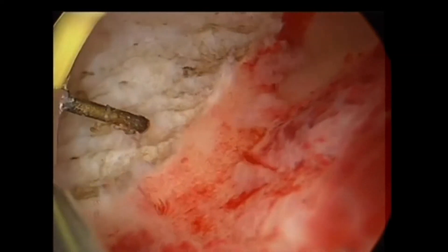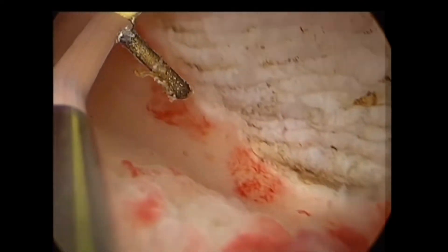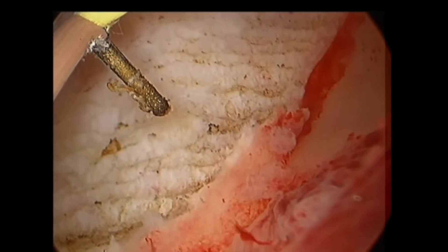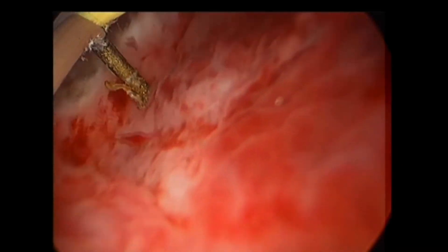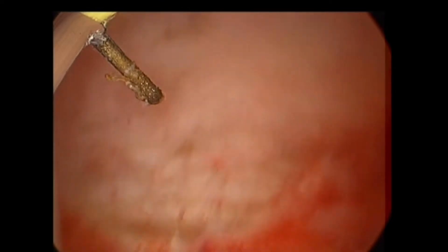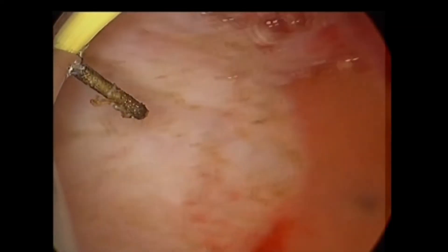Look at the endometrium here and the septum scar here — there is no residual tissue, which proves there is no need to excise. I'll decrease the fluid pressure now to allow the septum scar to collapse and the uterine walls to fall down. You will see some bleeding, meaning intrauterine pressure is low, but still there is no bulging tissue. The septal scar is even at a lower level than the rest of the endometrium, confirming there is no need to excise.